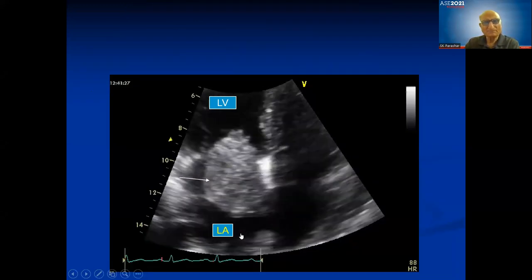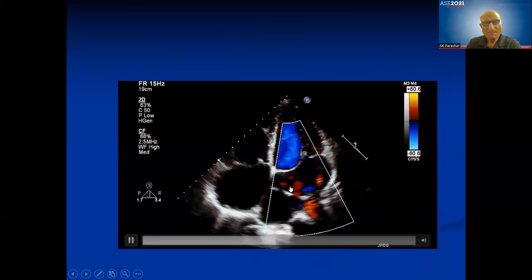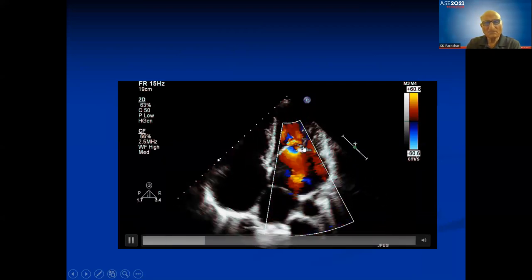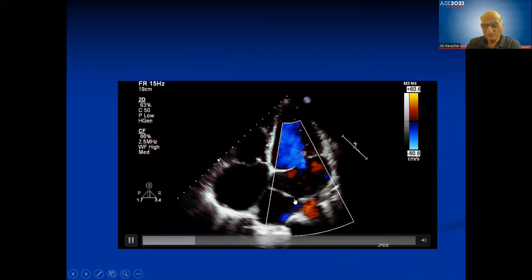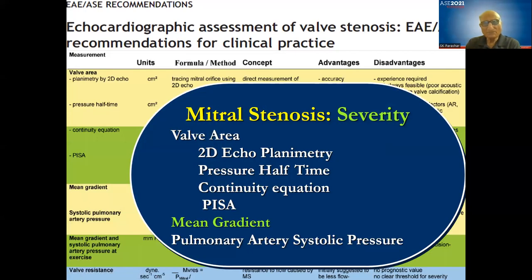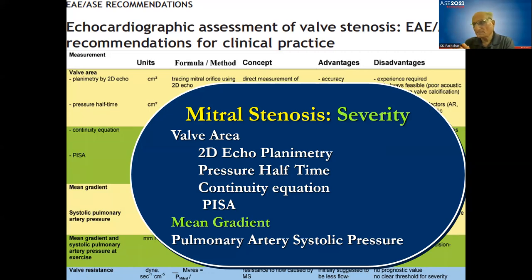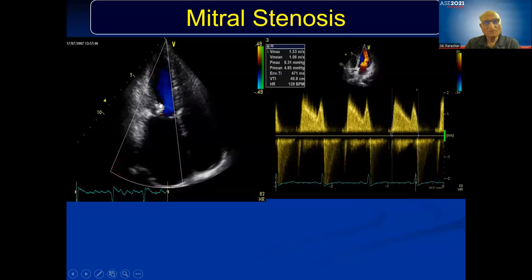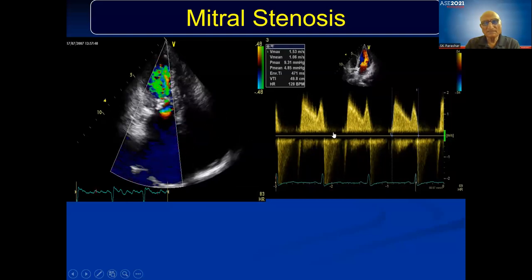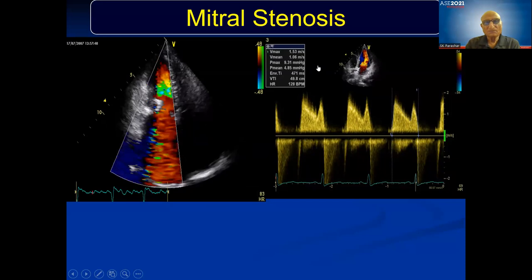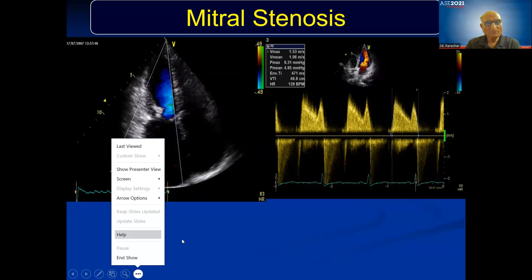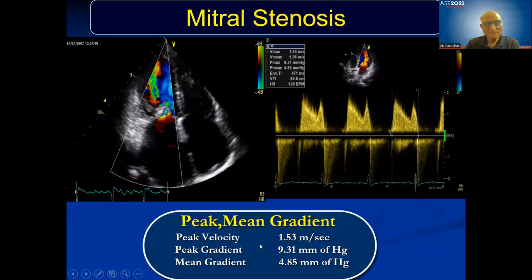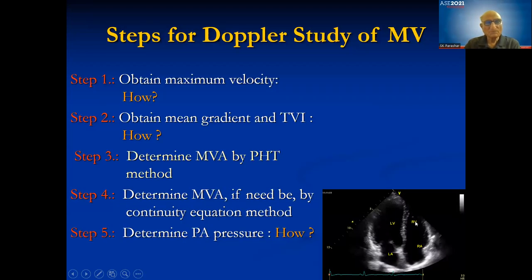Any obstruction at the mitral valve — such as a membrane in the left atrium or cor triatriatum — will produce a gradient. The mean gradient is measured by being parallel to flow and planimetering the Doppler envelope. In the apical four-chamber view, place color Doppler, then apply CW Doppler through the valve, planimeter it, and you automatically get peak and mean gradients and VTI.